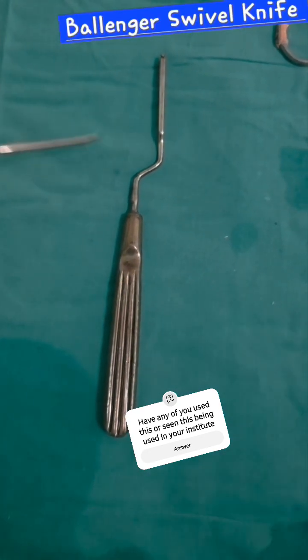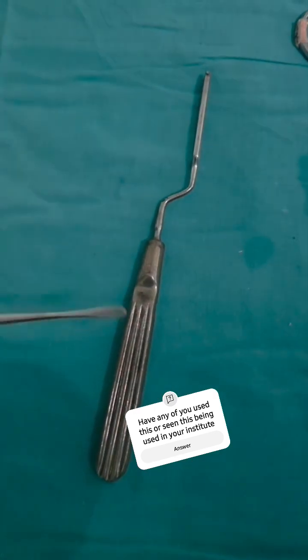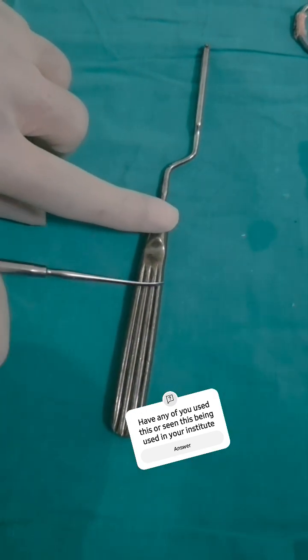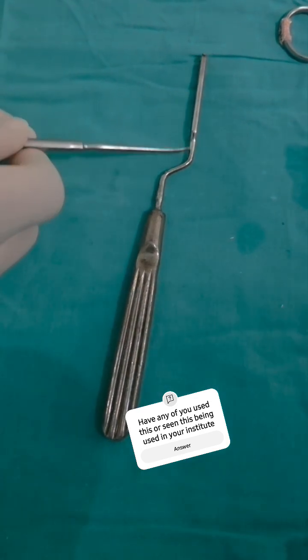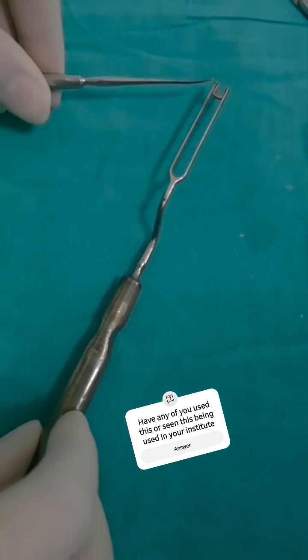This instrument is a Bellinger swivel knife, which is commonly used for septoplasty. Its parts are: this is the handle, this is the bayonet or the body, and this is the blade.